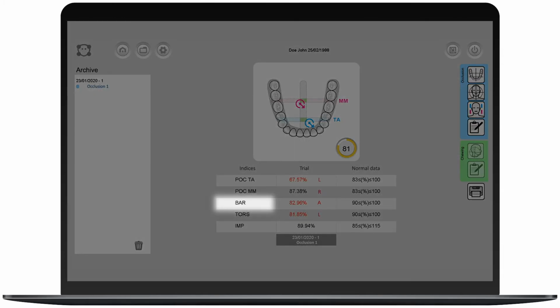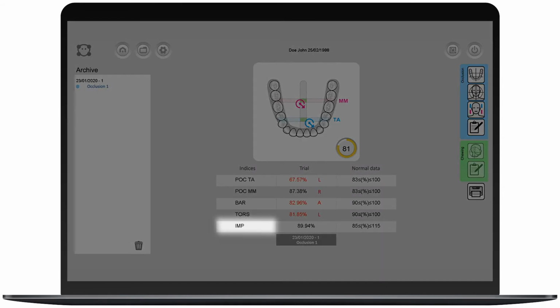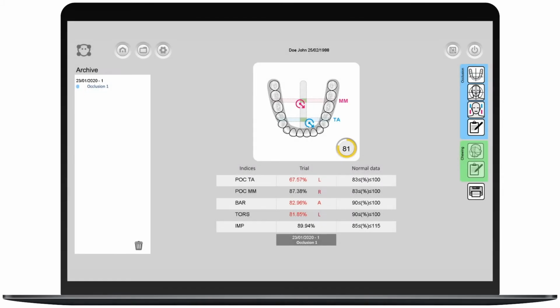The barycenter, otherwise known as BAR, that is related to the anterior or posterior behaviour. The torsion, noted as TORS, for the evaluation of the torsional behaviour of the jaw on the horizontal plane. And the impact, noted as IMP, for the evaluation of the muscular work. The values can be seen as graphical representations or numerical values.